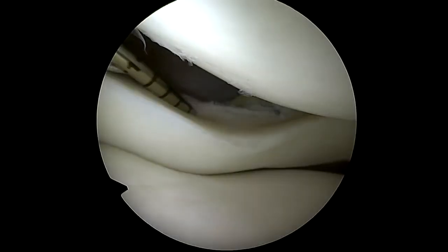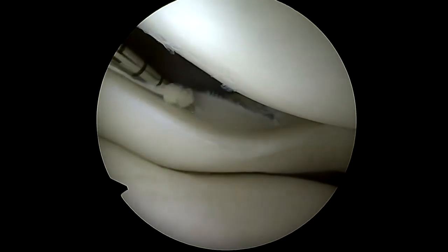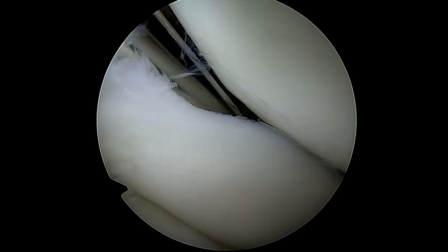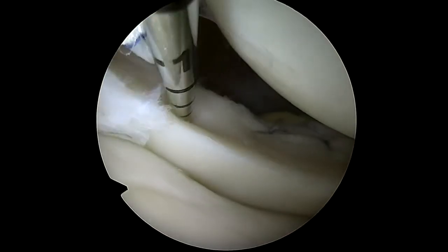The second superior stitch is then performed. These stitches are tightened to close the superior gap. Fixing the superior gap of the meniscus lifts the meniscus's free edge, subsequently exposing the inferior surface of the lateral meniscus.